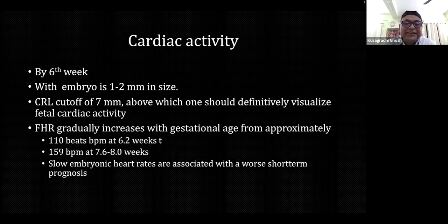Now, the last question is whether it really can cause harm. The harm is something which is relative. We should be very sure that we counsel the patient properly, that yes, we can see some sort of flicker, some sort of rhythm, some undulations, and we have to measure by M mode, not by pulse or color that much, especially for a prolonged duration. And it's not a time that you should start rejoicing and telling your friends and relatives and everybody that you're pregnant. Certainly not post on Facebook that I am pregnant, to be crestfallen later on.